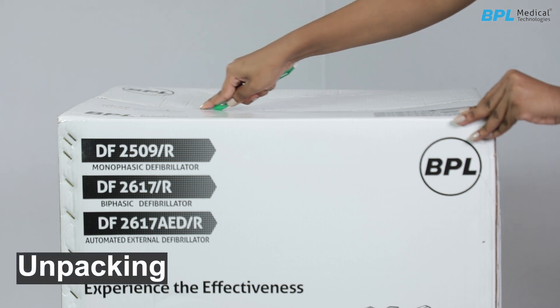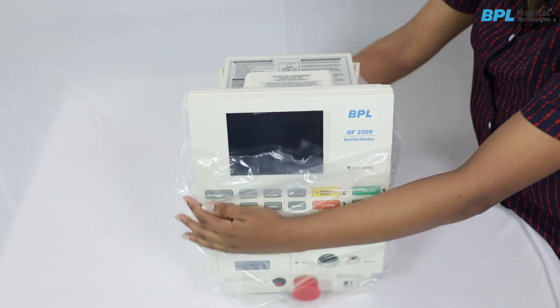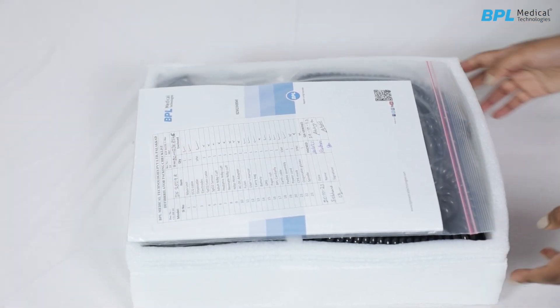Unpacking. Keep the carton upright. Remove the tape and open the flaps for the accessories carton. Lift the unit using the handle. Remove the polythene cover. Check for damage and notify BPL if evident. Take out the paddle set and accessory case from the packing cushions.